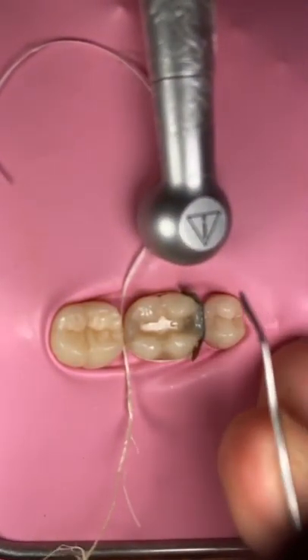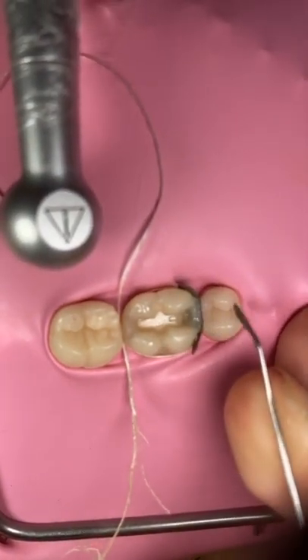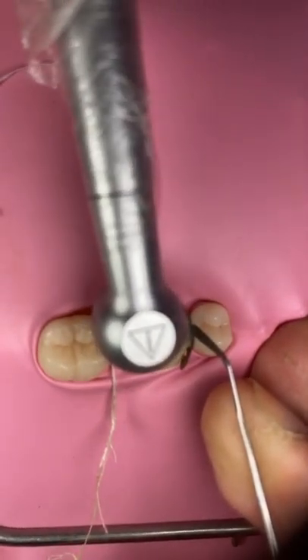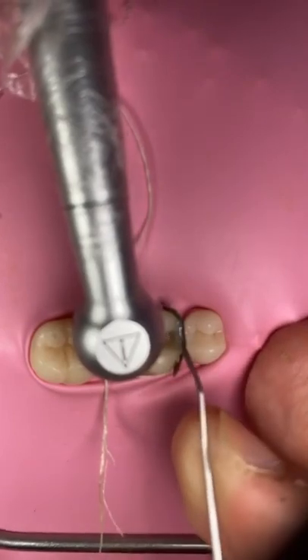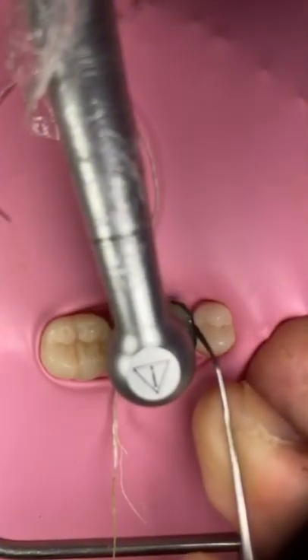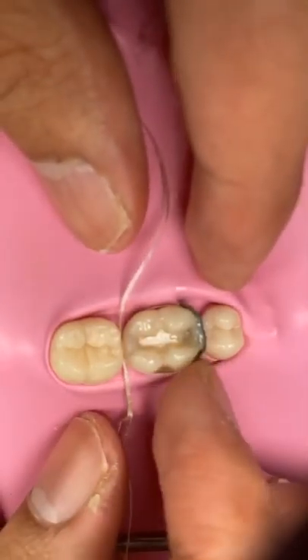And then just before you cure, don't forget to push the matrix toward the tooth, so that you create a very tight contact. Yeah, this is very important. Just before you cure, make sure that you push the matrix toward the mesial, so we will create a very tight contact. So you need to create that tight contact.